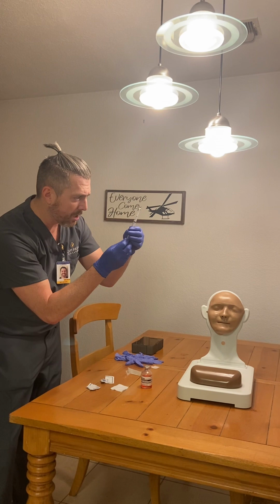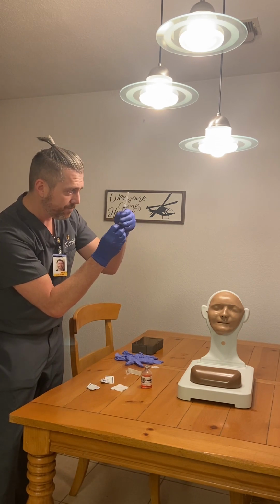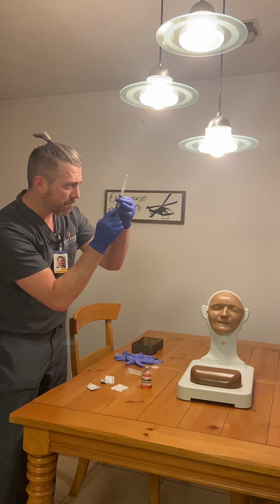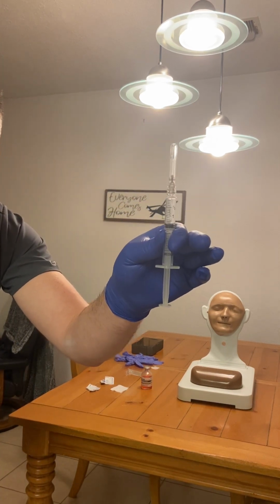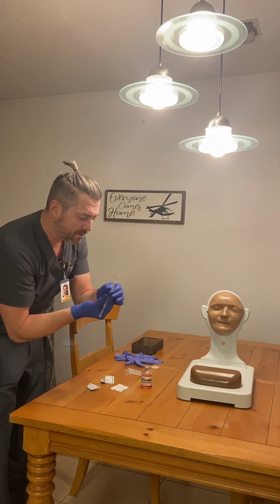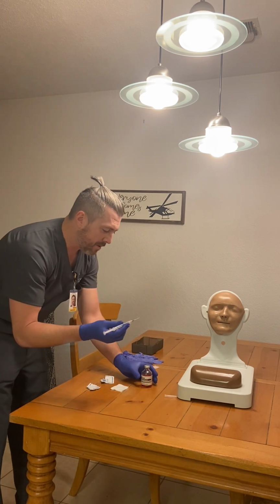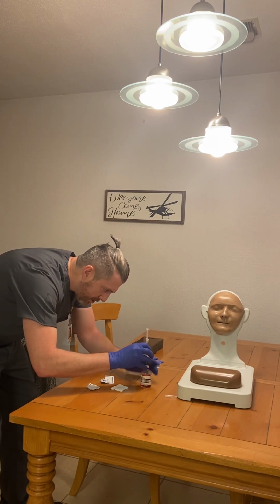With the bottom, we're going to pull up 1.5 milliliters of air. That's 1.5 mLs of air. Now the top has dried. We're going to remove the cap and put that close over here, since we'll be doing the scoop method in a minute. We're going to inject straight in without touching the tip to the medication.